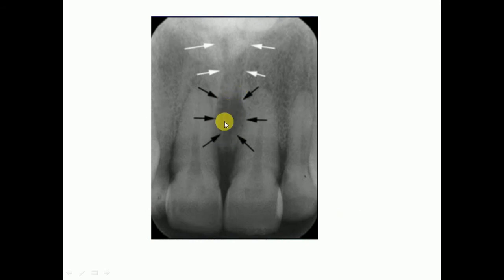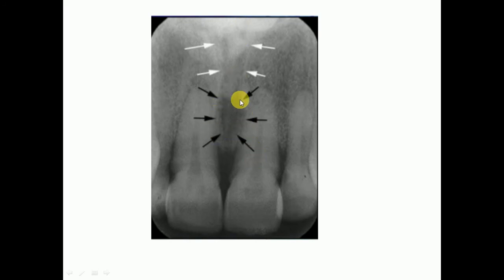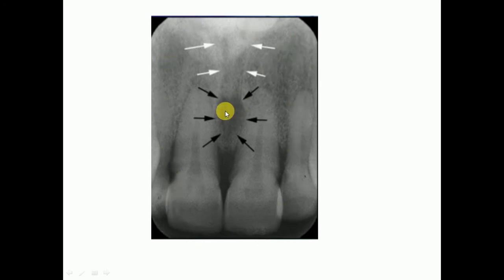Remember, the black area on a radiograph is known as radiolucent, whereas the white area is known as radiopaque. This is the radiolucent area visible on the periapical radiograph.